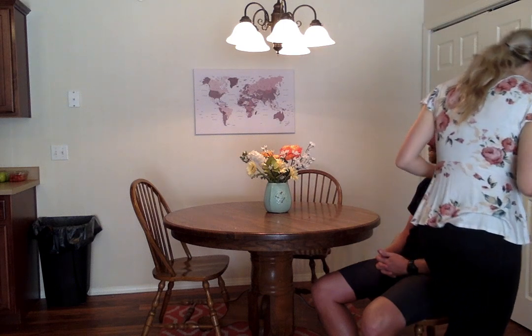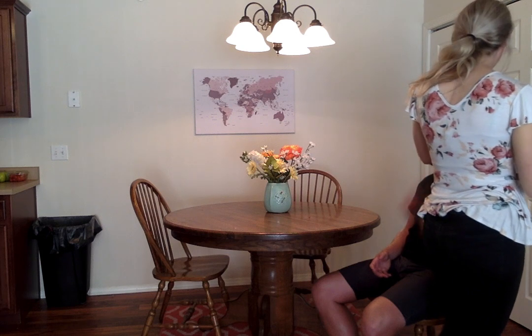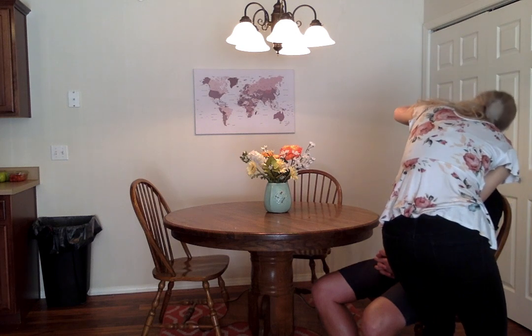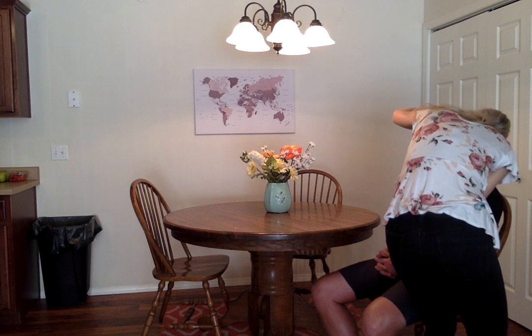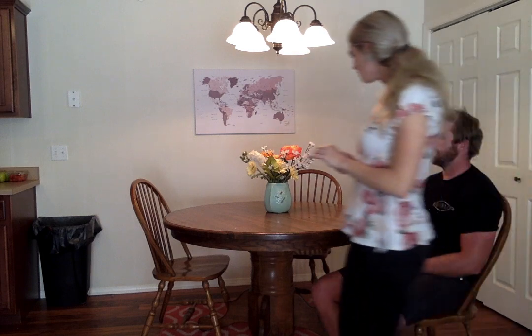I would pull the pinna up and back, and I would look at the canal, and then I would look at the tympanic membrane, making sure that it's a pearly gray, and it is. Then I would look at this side also, pulling the pinna up and back, visualizing the canal, and making sure that the tympanic membrane is a pearly gray. And it is. After the ears, I am now ready to move on to the nose.